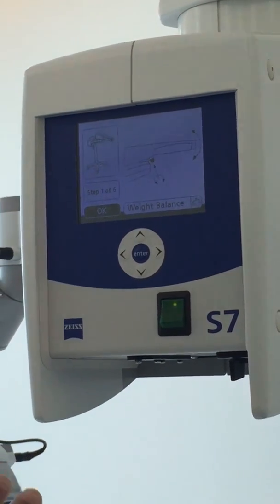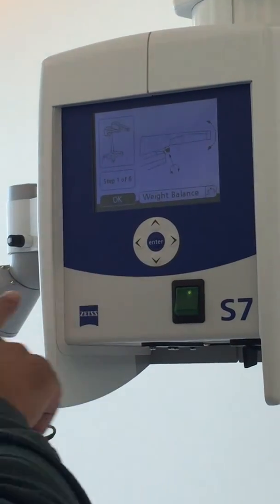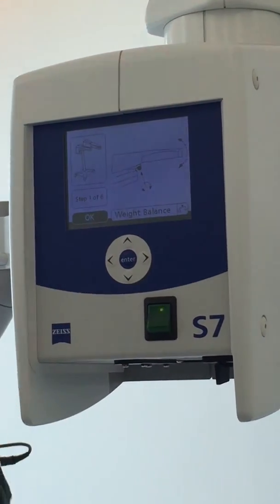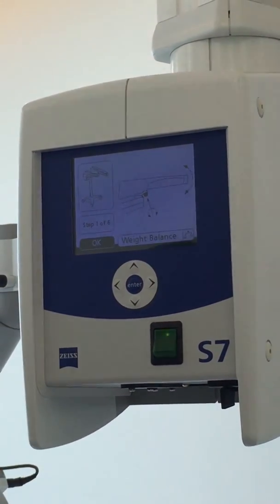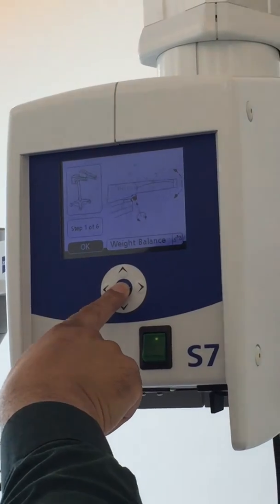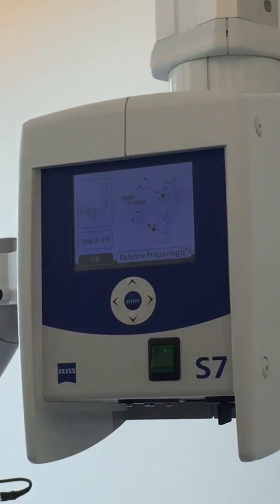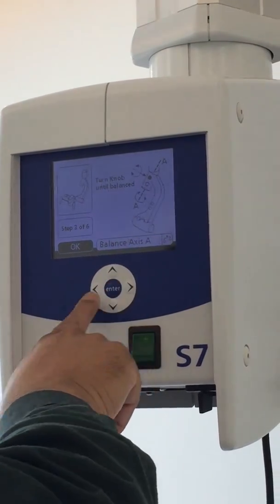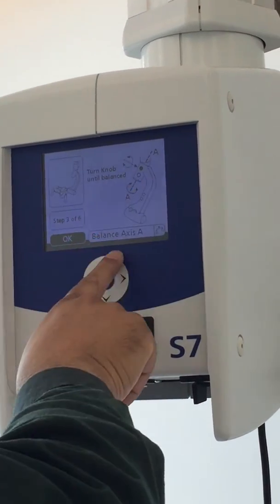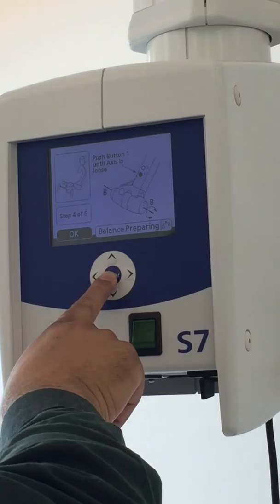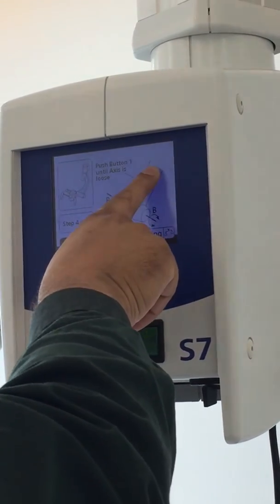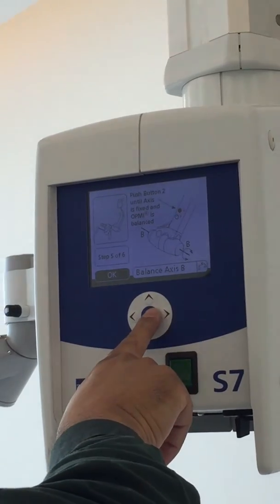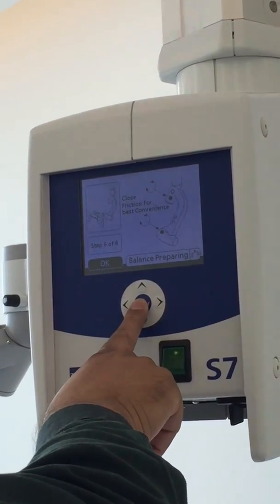This is not automatic balance. It's just giving you the instructions. First, what do you do? You did that balance. So you go and balance it and then you say, okay. Then open the friction knobs. Balance this axis. Step three. Step four. We are pressing axis. Yes. So all the steps are described.